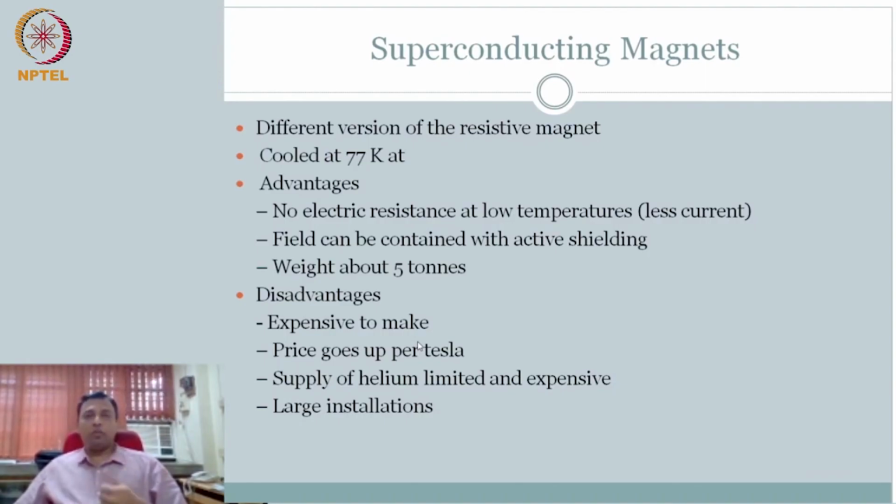So if you are referred to a diagnostic center, if they have 1.5 Tesla, you'll be charged some amount. But if you go for a 3 Tesla, it will be more. You might think, oh, it's the same MRI scan of my knee, for example, but the cost is different because it's a different Tesla. What do you gain? With higher Tesla, your image quality is probably going to be better. So that's the price that you end up paying.